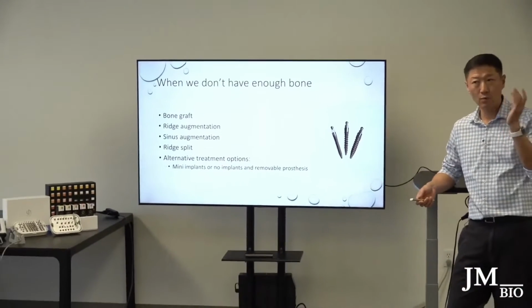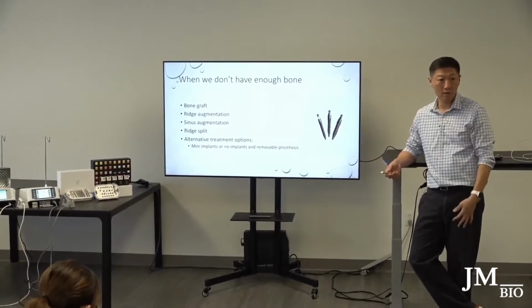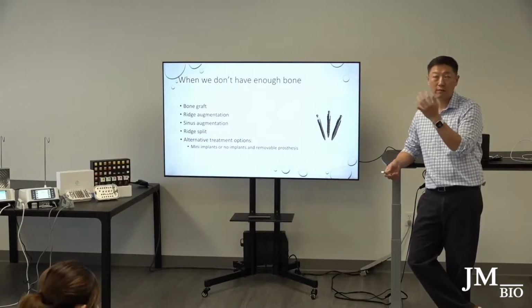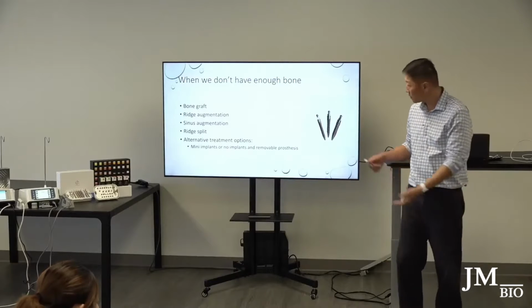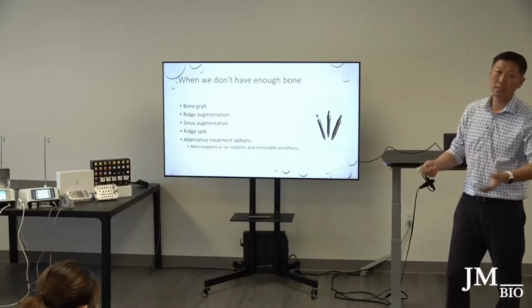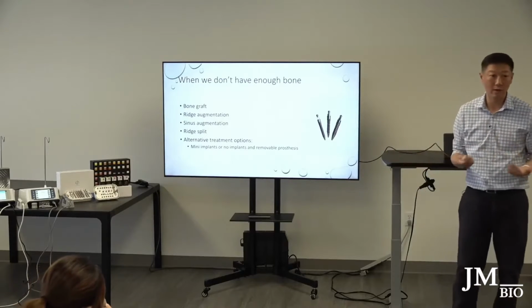There was a case where I did a full arch case, and I needed to stabilize her dentures until they healed. So I placed 4 or 5 mini implants and had her wear her dentures, and she was happy for the time being until her regular implants healed. So there is a time where it's called for. This is where I say use the tools to our advantage, for the patients.